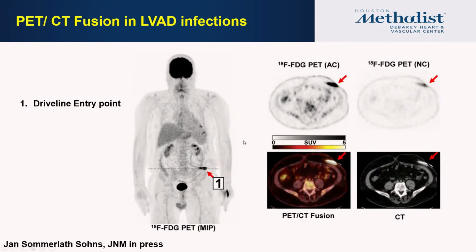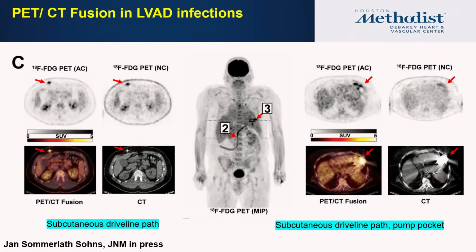You can also see in this patient, for example, in the drive line, at the entry point, very hot uptake, and this could be an abscess there, and these patients will require immediate attention and therapy. And you can also look at it in multiple sites.